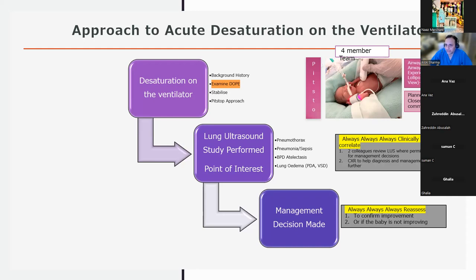And I definitely say that for respiratory distress and congenital pneumonias, where you might have localization, or alternatively episodes where a baby might have aspirated milk, we know that the right main bronchus is a little bit more vertical. So again, it's really important that you're doing a comprehensive scan, and a scan that's clinically indicated, when you're thinking of pneumonia as a possibility.